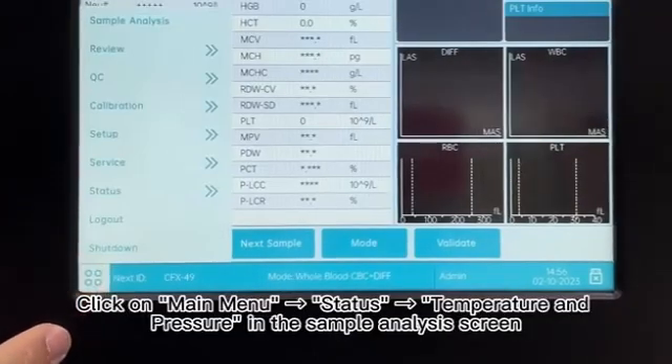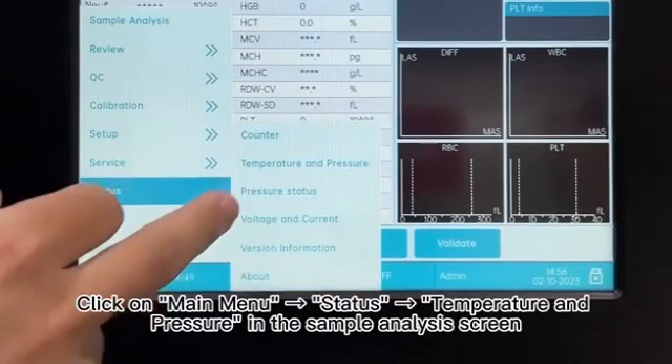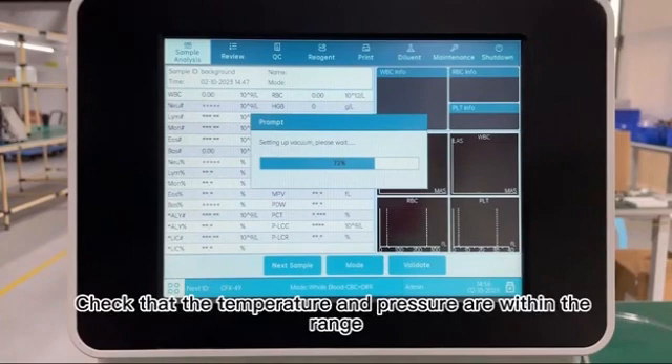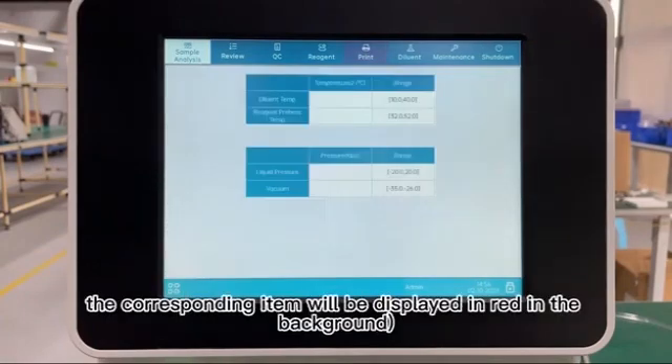21. Click on Main Menu, Status, Temperature and Pressure in the Sample Analysis screen. 22. Check that the temperature and pressure are within the range. If out of range, the corresponding item will be displayed in red in the background.